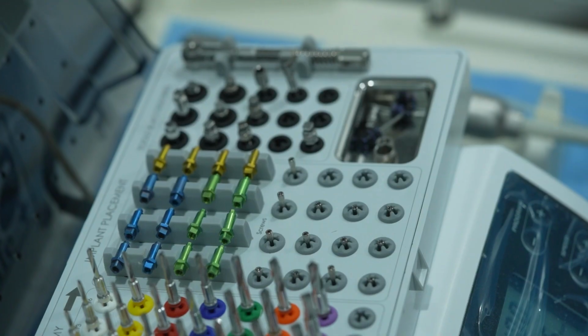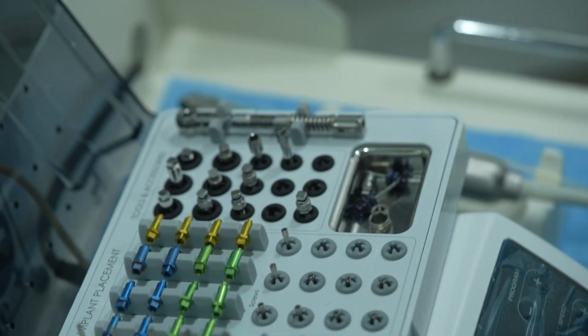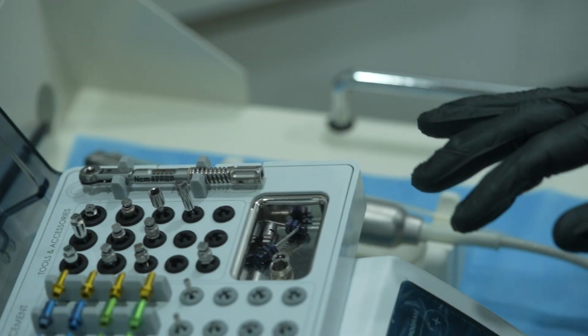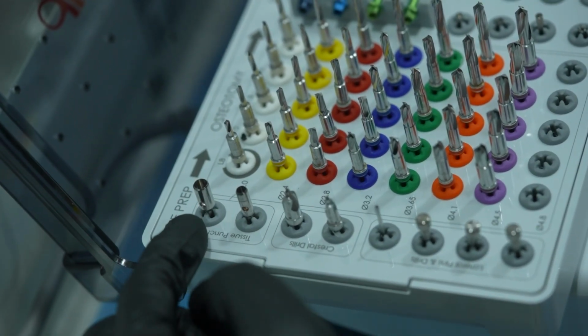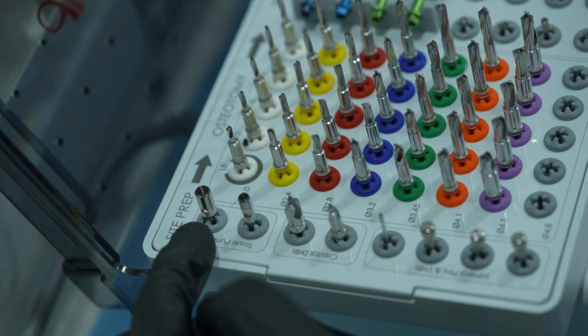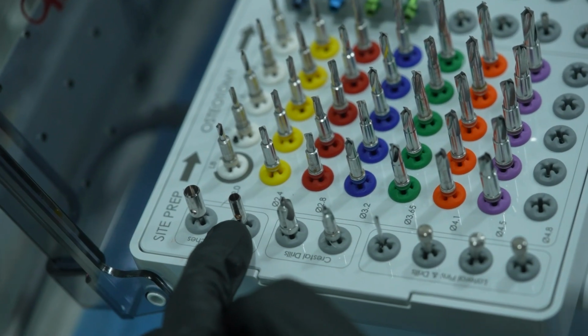Since we already have the denture in this scenario, our next scan would be with the denture. Okay, today we are going to use the Alpha Bio implant system. This is the guided kit of the Alpha Bio system. I will just explain a brief about it. So this is the tissue punch, small and large. When you are using a larger diameter, more than 5 mm, you will use the large one; less than 4.5 mm, you will use the small one.